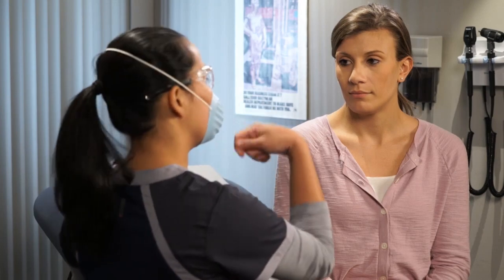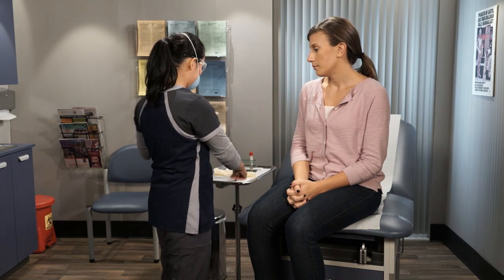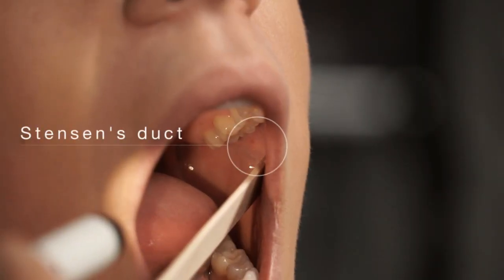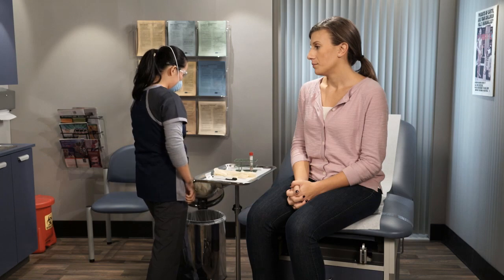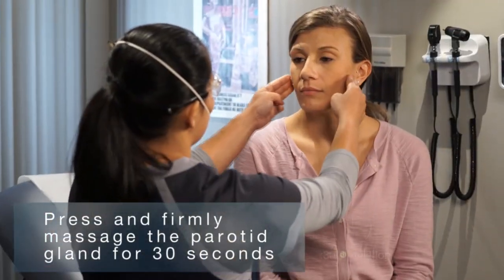Explain to the seated patient the importance of collecting a buccal swab to test for the mumps virus. Instruct the patient to open her mouth. Locate the Stenson's duct on both sides using a tongue blade. Instruct the patient to close her mouth. Press and firmly massage the parotid gland for 30 seconds.